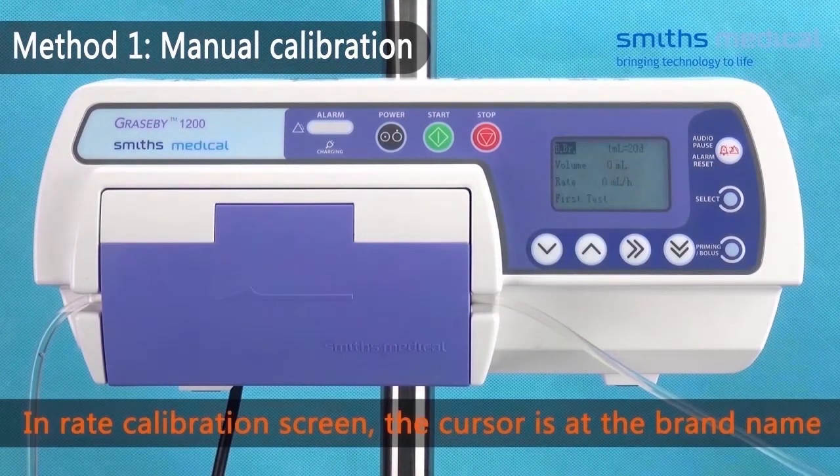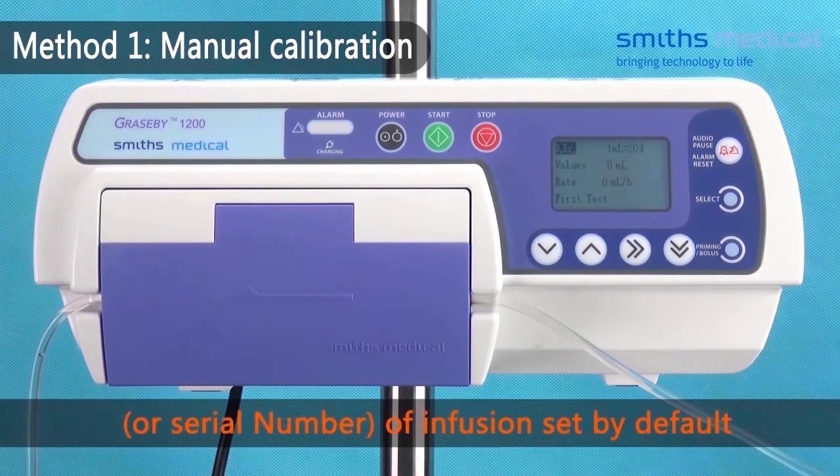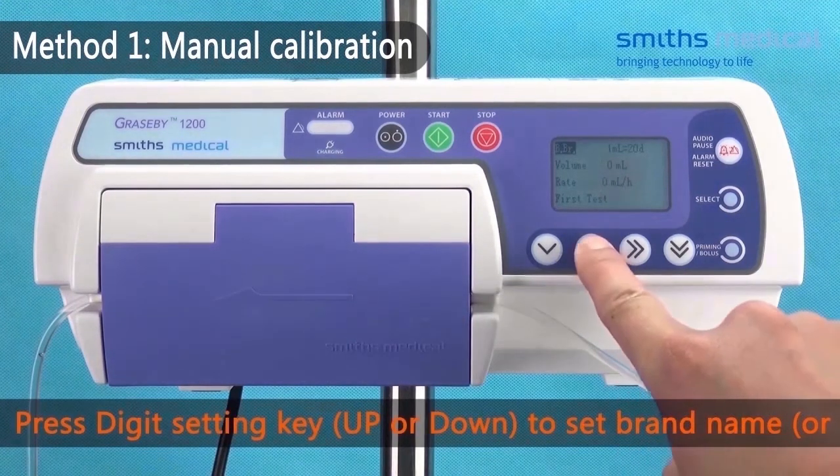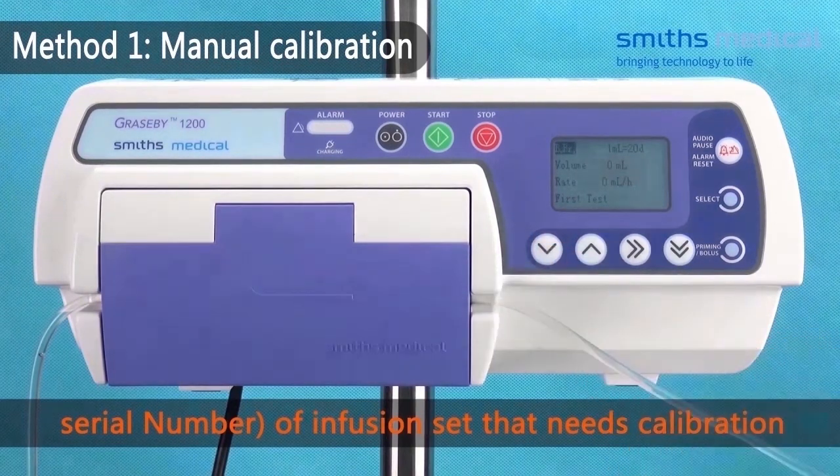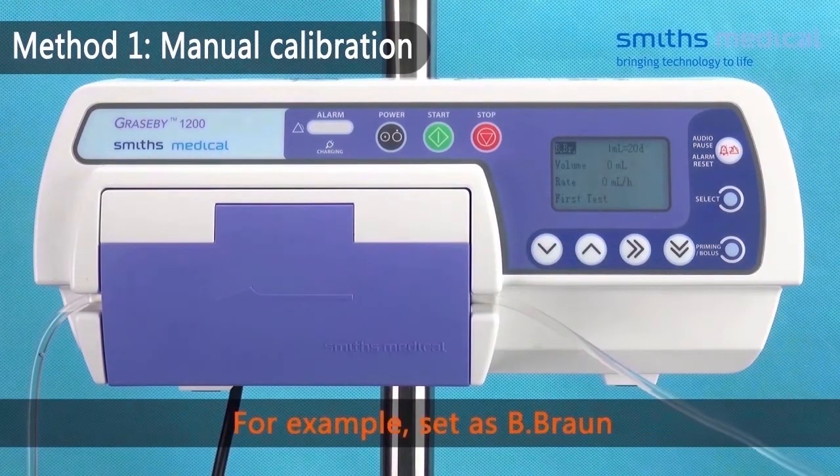In the rate calibration screen, the cursor is at the brand name of the infusion set by default. Press the digit setting key to set the brand name of the infusion set that needs calibration. For example, set B. Braun.